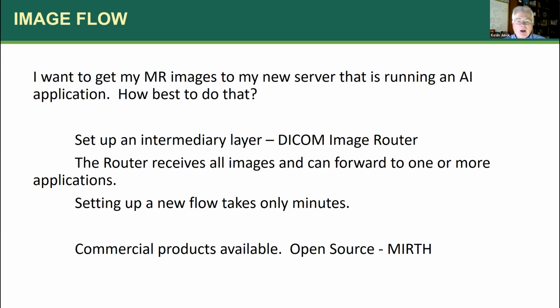Now, there are commercial products available for these DICOM image routers. We utilize one here at UAB from a company.